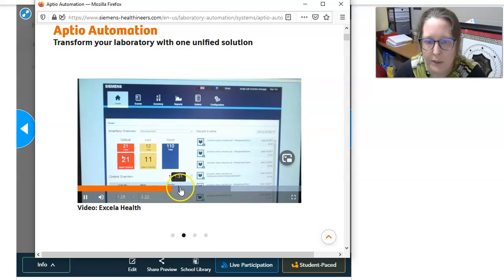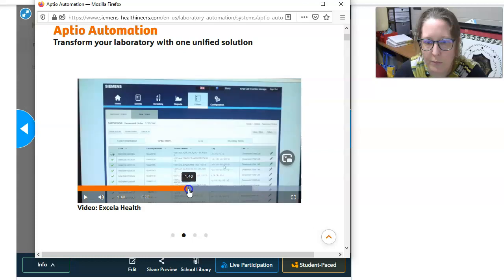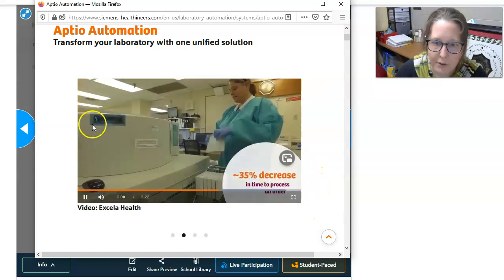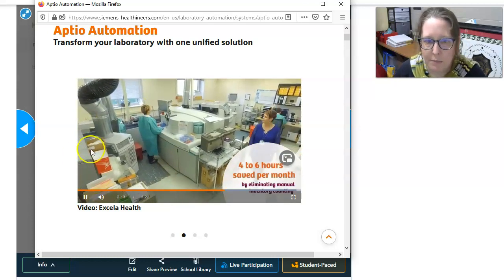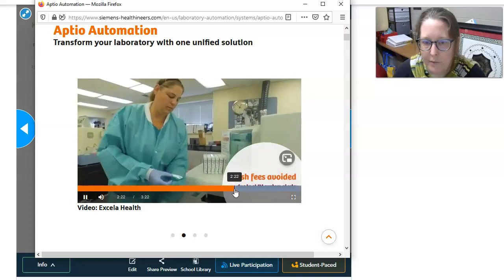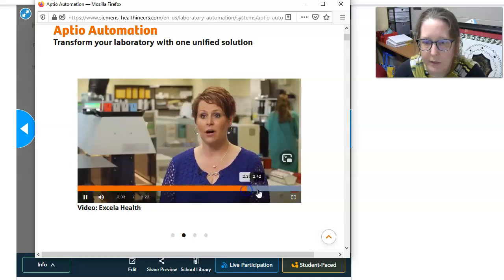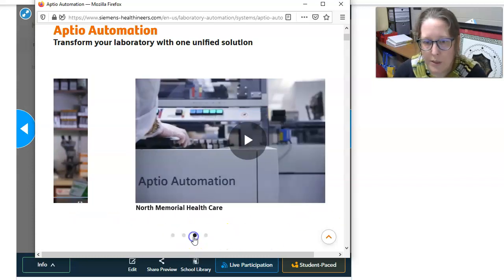So further in, see what it looks like. It's showing a little bit more in the system. Once we implemented the SLIM system, you can see it seems like a long assembly line, and everything is connected, and then specimens can move back and forth between the different types of analyzers and the storage analyzer and all of that. And this is cartridges and stuff like that going in. So anyway, this is one of the ones.